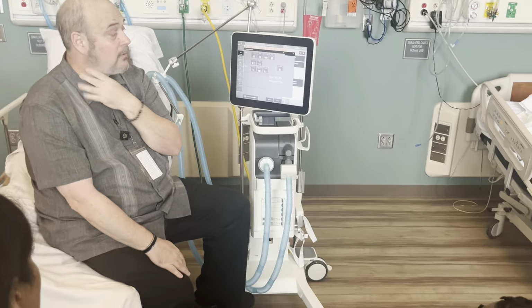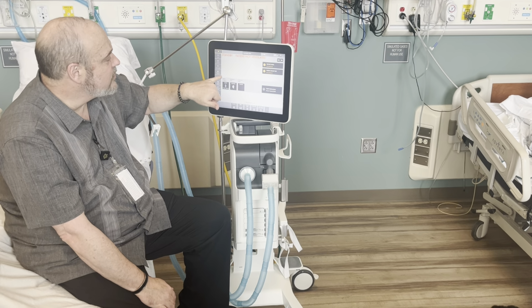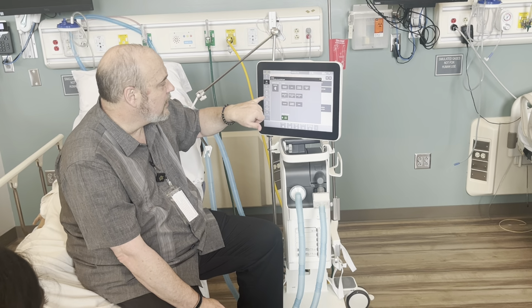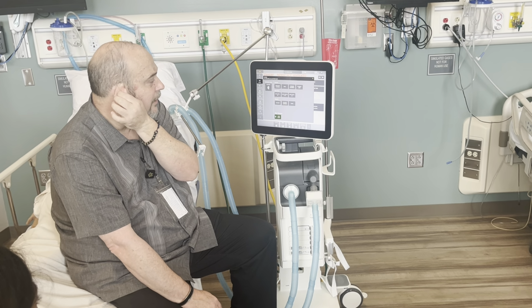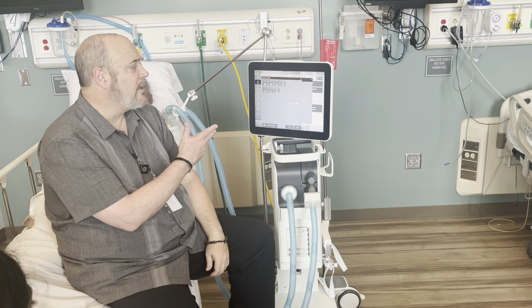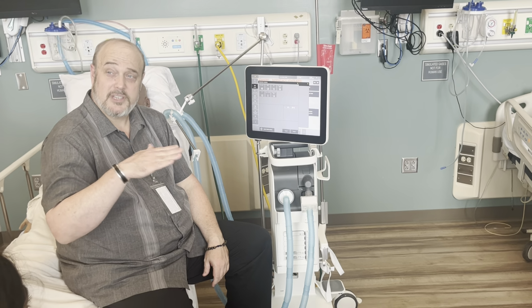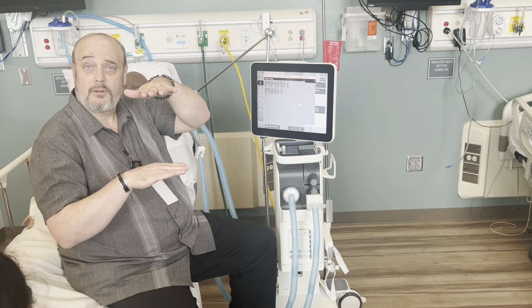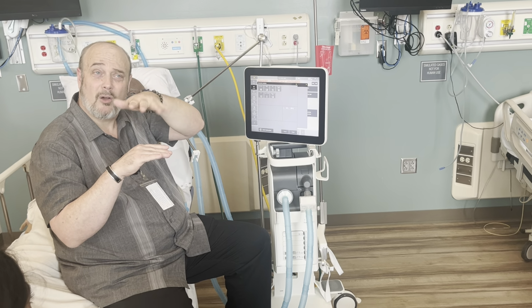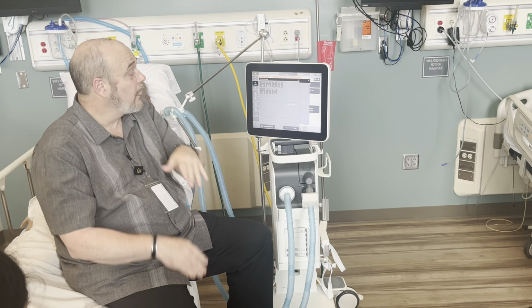Okay. Now, the part that Marnie's going to be going over with you too, and part of what Calvin's going to do, is we're not going to break down these modes of ventilation today. That's going to be a little bit later. But basically, in a nutshell, pressure control ventilation. So just like we talked about, I keep going back to the very beginning. You have CPAP, right? Then you have pressure support. It's the exact same thing, but now I'll give it a rate. Instead of it being called pressure support, it's now called pressure control. There's no other difference.